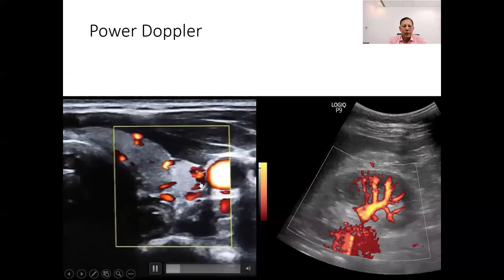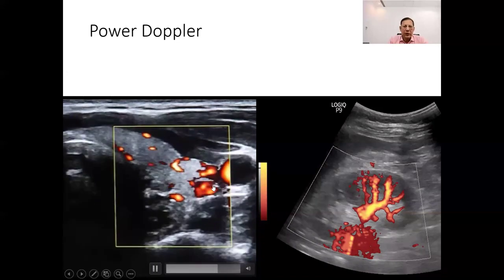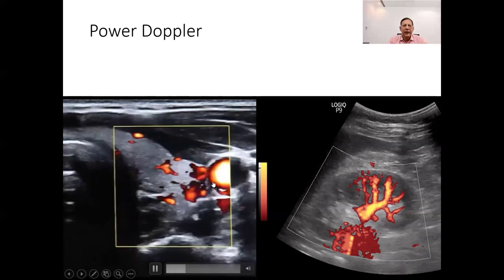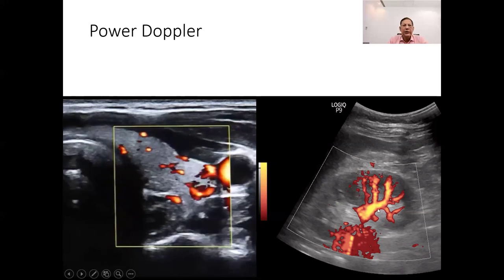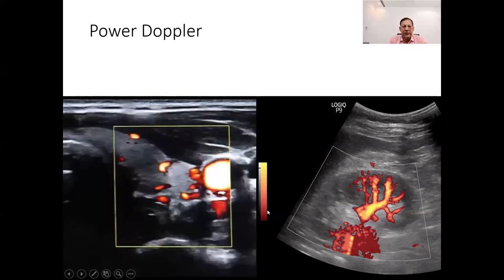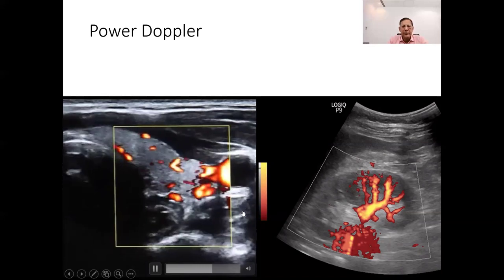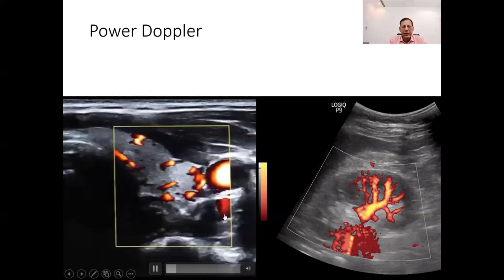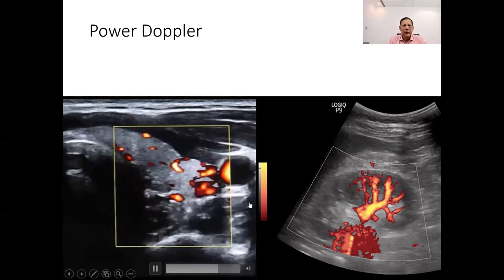and small vessel scenarios, providing crucial information for various medical diagnoses and treatments. Unlike conventional color Doppler, which is shown in two colors, that is red and blue, power Doppler is shown in one color, usually yellow, as it doesn't show the direction of flow, so it is not useful for situations where knowing the flow direction is important. In summary, power Doppler is more sensitive to low blood flow than regular Doppler.